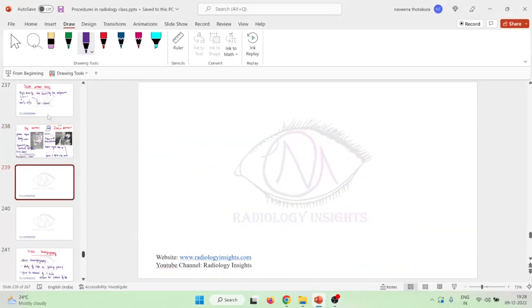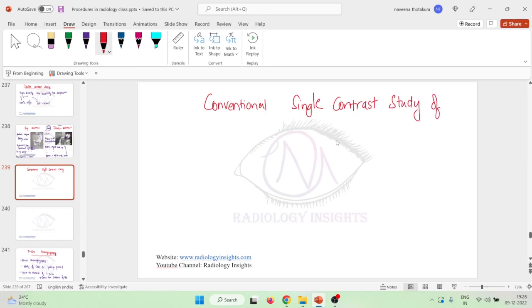Hello friends, let us now learn about the barium meal. In the barium meal, let us now learn about the conventional single contrast study of barium meal. So in this conventional single contrast study of barium meal, it is done at 80 to 90 kilovolts.